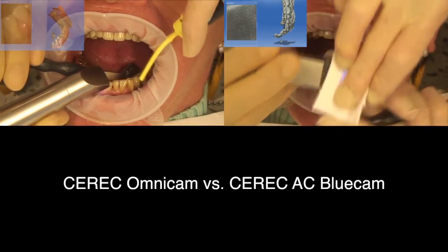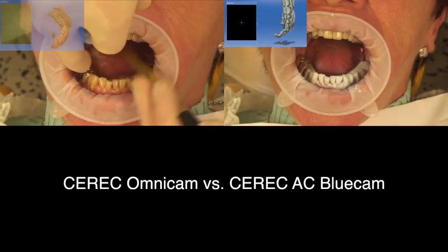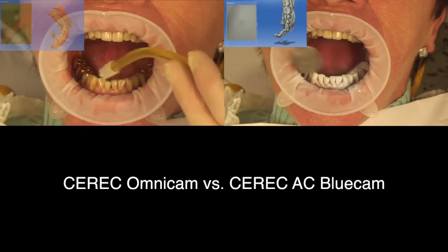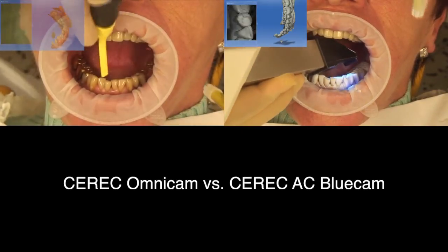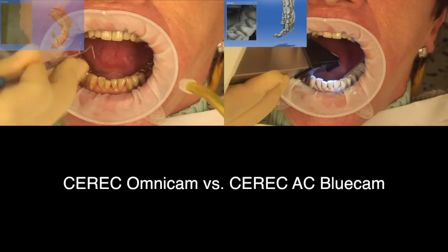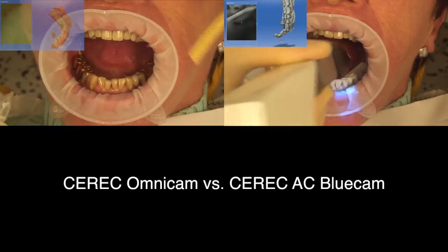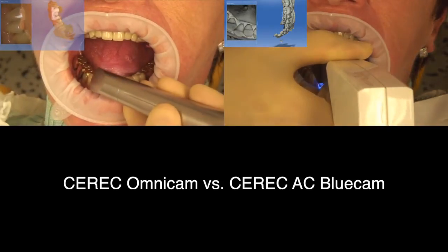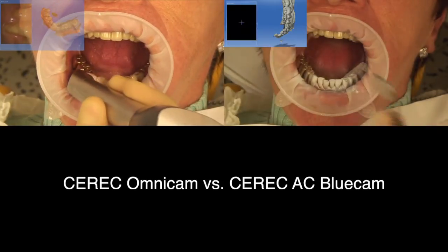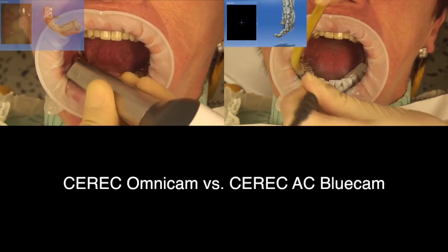The scanning strategy is identical for both cameras. You can't, and you actually shouldn't, scan the whole jaw in one go with a whole jaw scan, as it would be very difficult to do. It's therefore recommended that you dry an area, or powder it if you're using the Bluecam, scan it, and then overlap the scans, and then go through the whole thing again. You dry or powder an area, then scan it, and so on.